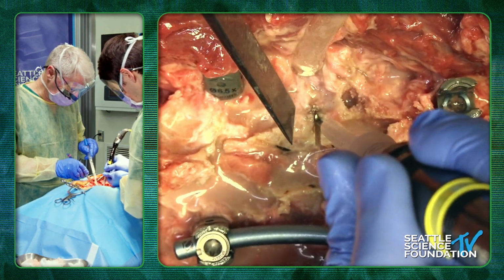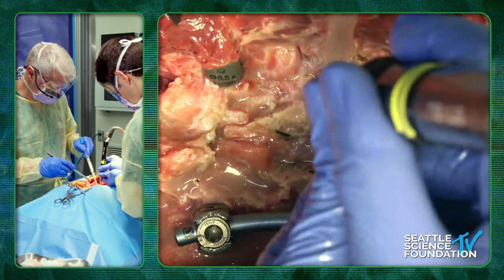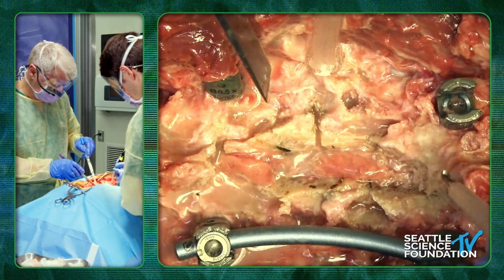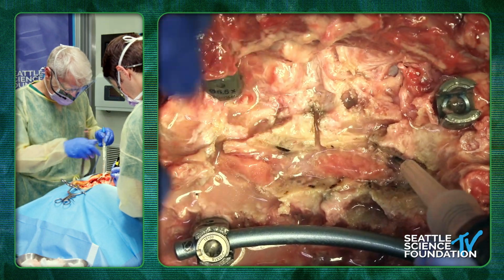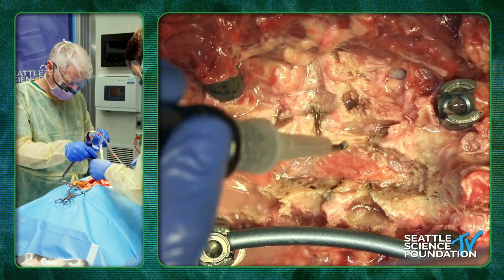He's going to cut right over the nerve root there. Okay. Is he through? There's a little bridge. Okay. And then he's going to separate the superior facet. So you're going to come in this way over the pedicle and take out the superior facet here.